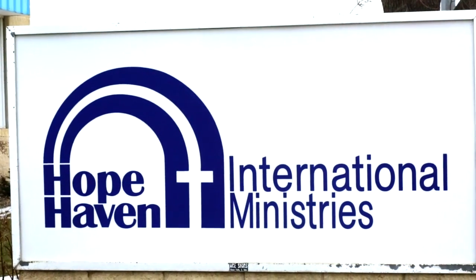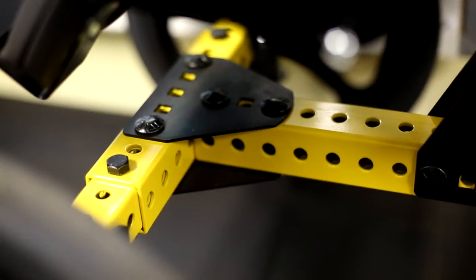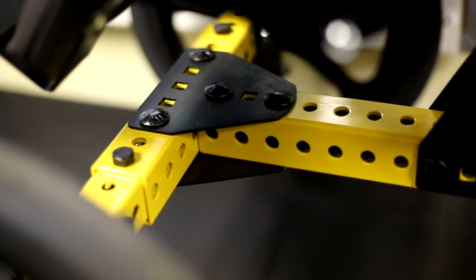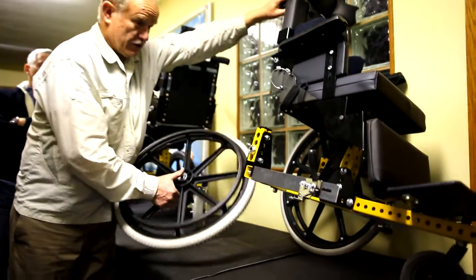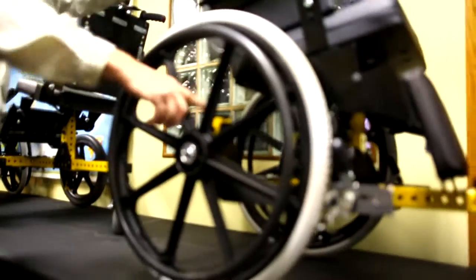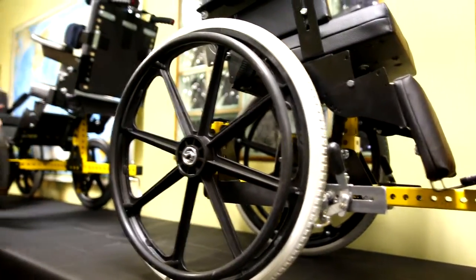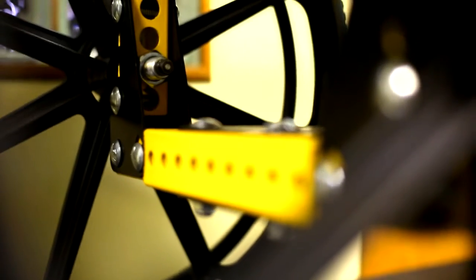It depends on how big the tubes are, but this one I can make this chair grow for probably 10 years of someone's growth. I can put a 26 inch wheel, a 24 inch wheel, a 22 inch wheel, a 20 — and then if you'll notice this next chair, by flipping this upside down, now I've gone to a 16 inch wheel and I can go to a 12 inch down to an 8 inch wheel.